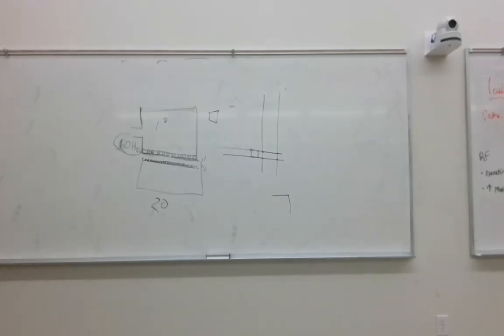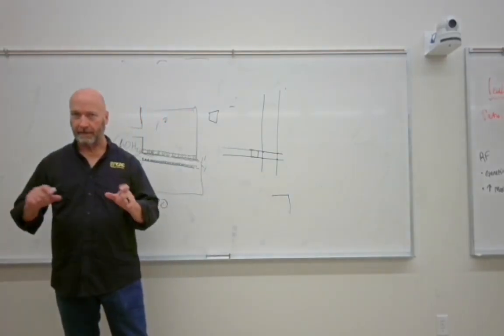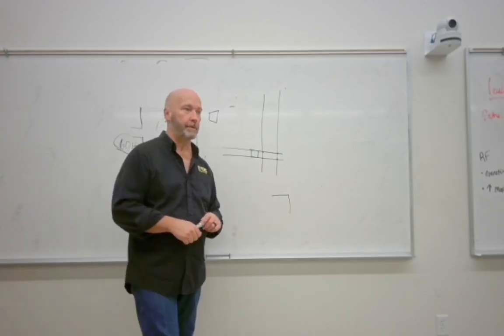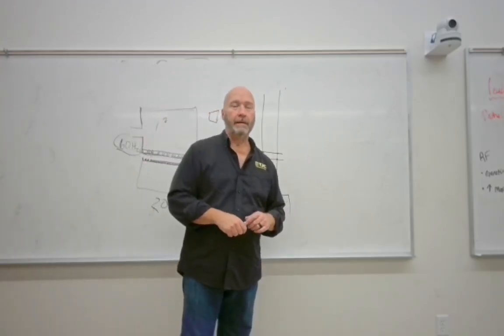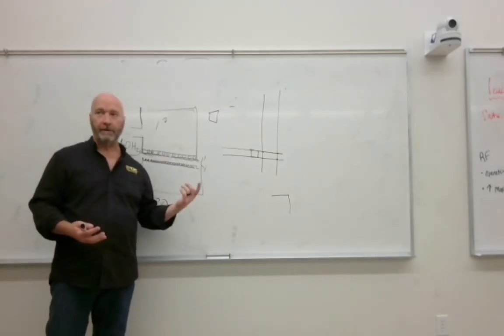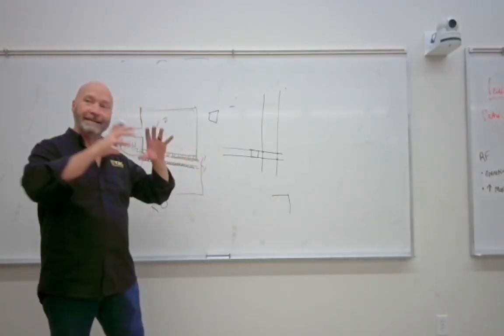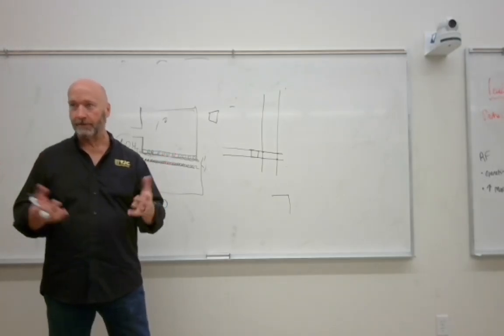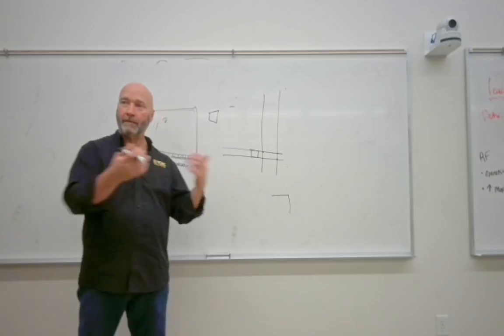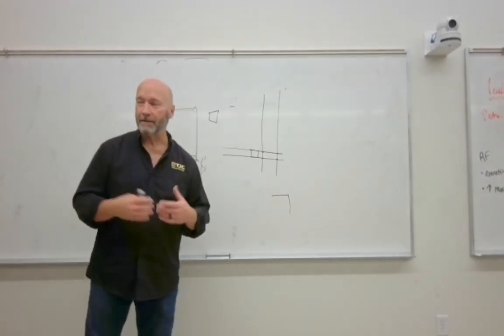Okay, so regardless of what type of room we have, we're going to have four basic components. What you use to make your exposure, the thing that you have to set up, is what we refer to as the control panel. And we've got the X-ray tube, and then we have the high voltage generation system. So again, now we're back to calling it generation as opposed to just transformer. When we're talking about the high voltage generation system, we're talking about the entire thing where we're going to generate the high voltage. We're not going to generate electricity that's coming to us from a power plant. We're going to generate the high voltage. Okay. So don't let that confuse you.